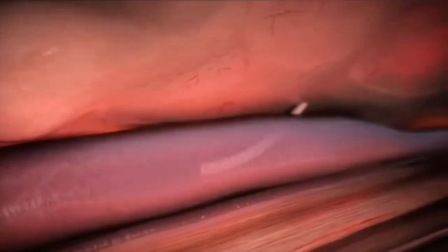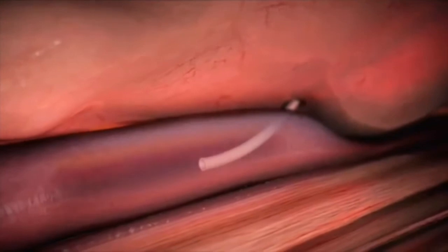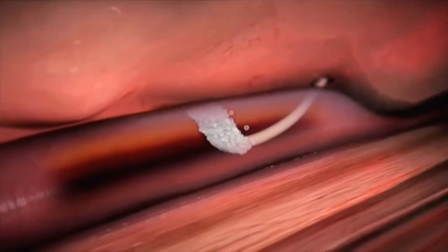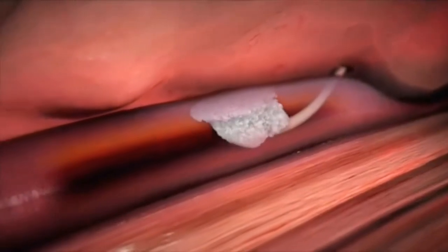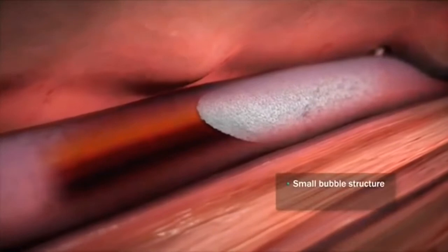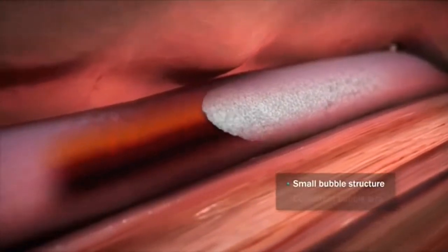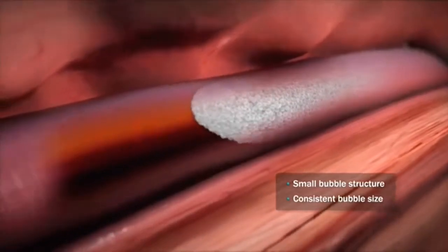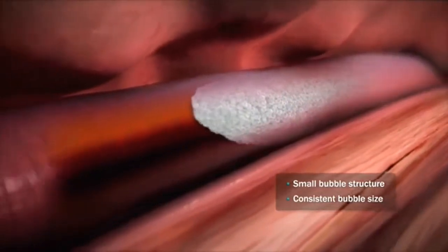Having confirmed venous access, the vein distal to the access point is compressed prior to the injection of Varithena. When injection begins, a column of microfoam advances to fill the vein. The physical properties of Varithena, with its small bubble structure and consistent bubble size, make it cohesive, aiding in the displacement of blood and facilitating the filling of the lumen.